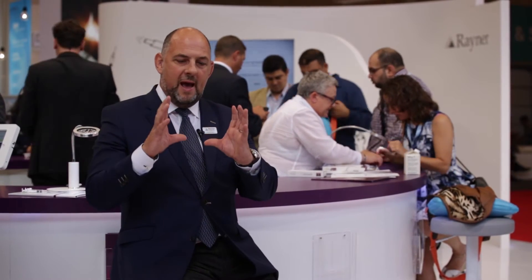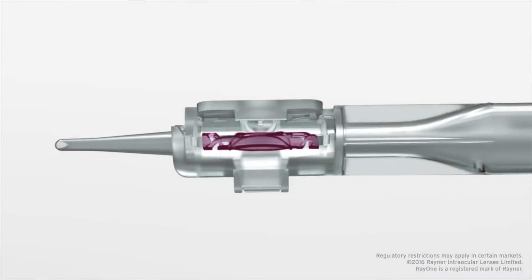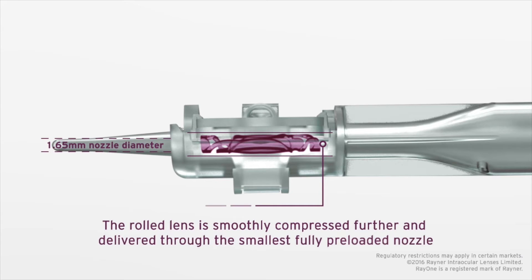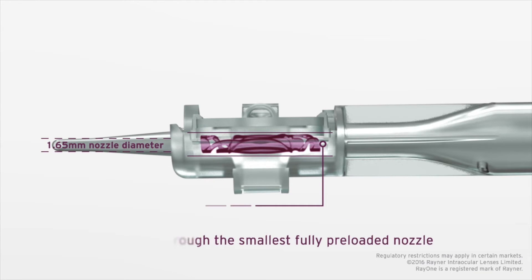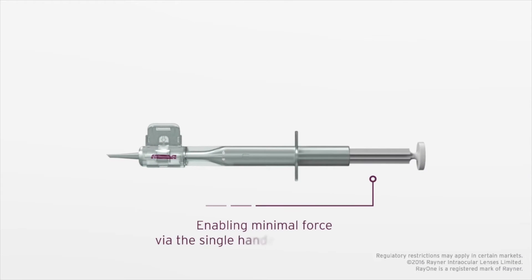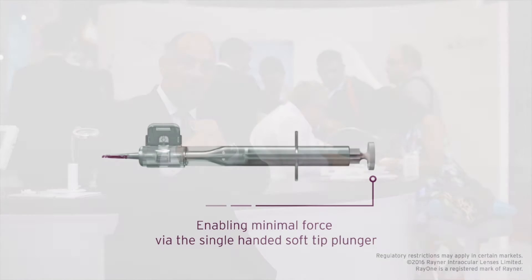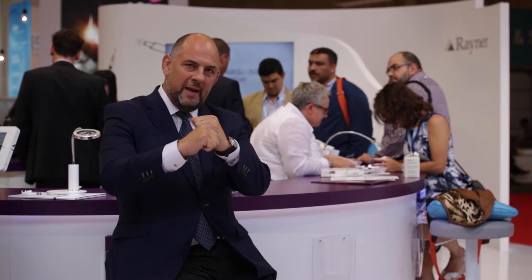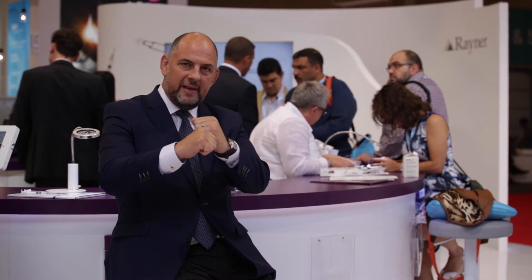With Ray-1 we effectively have a cylindrical system that the lens sits in. As we fold, we're rolling the cylinder and making it ever smaller, rolling the lens at the same time. This does two things: the lens is consistently rolled for every diopter, every time, every patient. And all the energy is taken up in that first movement, then the plunger pushes the lens through the tip with limited force.